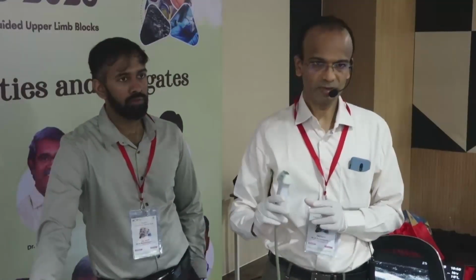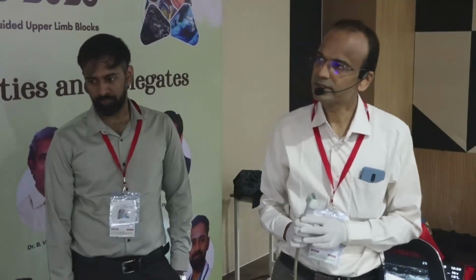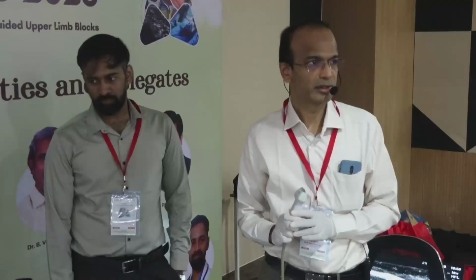Then further we move away, that is mid-humeral level. There we see individual branches. So then the next level is wrist and elbow. Obviously we see individual branches. So is it necessary to scan root to individual branch?